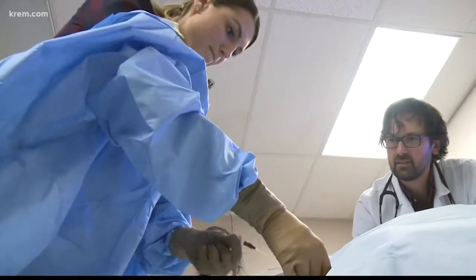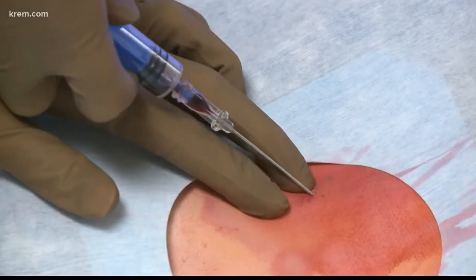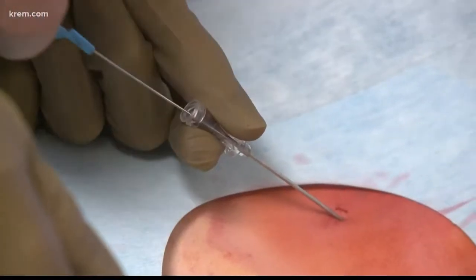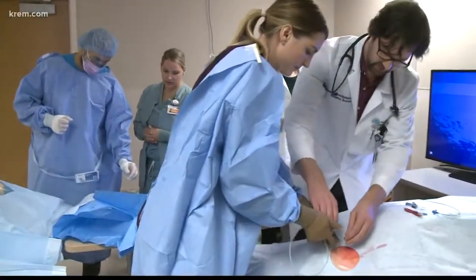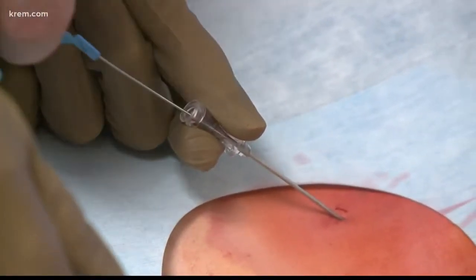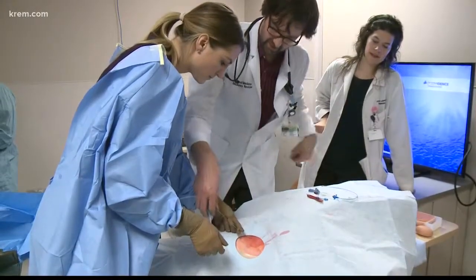Dr. Ledyard is preparing for her upcoming ICU rotation. She is learning how to place a central venous catheter into a lifelike dummy that bleeds and can communicate like a human being. To kind of feel better how it's... I see what you're saying. Placement of this long, flexible tube that is used to give medications, fluids, and nutrients over long periods of time is a routine procedure but can be difficult in an emergent situation.